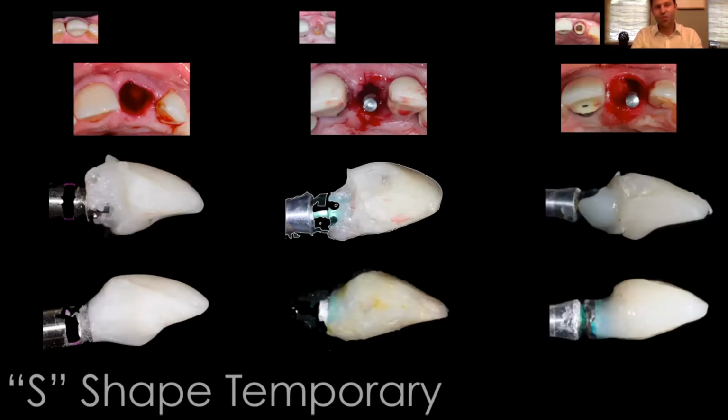So then it's creating the architecture of this S shape of the abutment to the tissue, but everybody's case is different because there's a different gap between the tissue and where the implant is. And so in order to have a sufficient amount of bone placed there, you really have to create the architecture of this temporary.